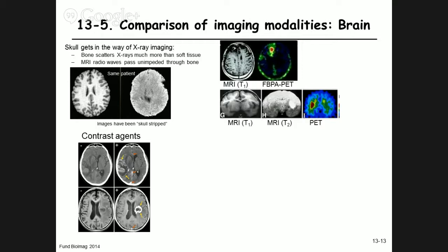Well, one thing that you can see is they're fairly similar in the sense, again, that on the surface, now this is not skull stripped, the bone on the CT shows up bright, lots of electrons. The fat on the MRI shows up bright, lots of short T1 components. So it's a T1 weighted image. They have in common that on the left is a native image, so inside the brain, weak contrast for CT, relatively strong contrast for MRI.